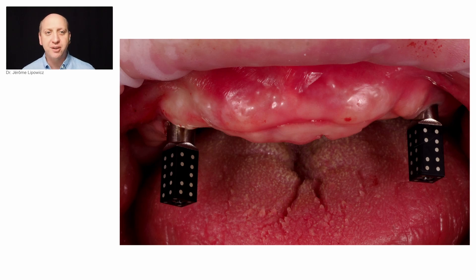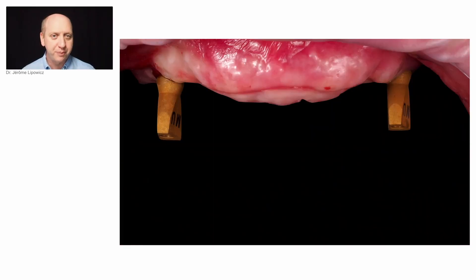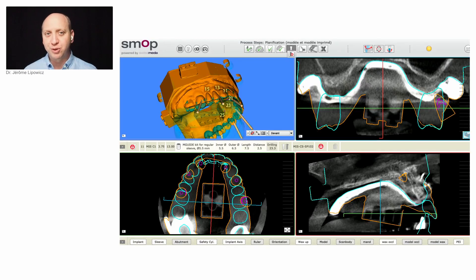And with this method, we get the most accurate measurement of the distance between the two implants without any distortion. We will align the position of the two remaining implants with a conventional digital impression that will capture the mucosa.